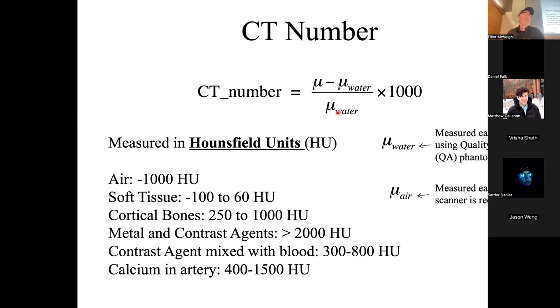And you calibrate your scanner every day such that that is true. So every day they put water in the scanner and they image it. They put an ROI there, and the underlying engineering, the machine goes, okay, that's my water for today, just in case there's some kind of drift in the X-ray power or something like that.